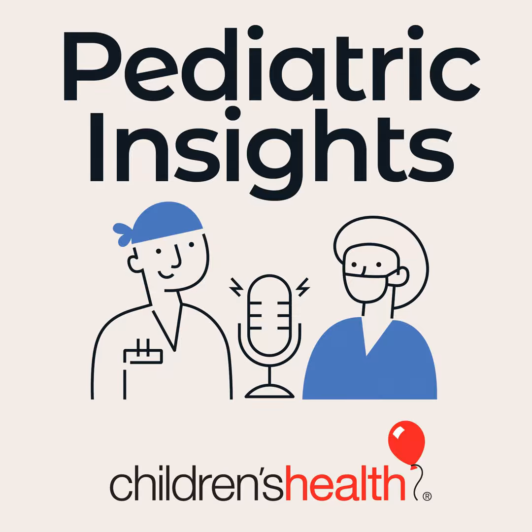So the beauty that I see, even in a very small child, and I use the robot in kids as small as 5 kilograms, and you can do even smaller if you need to, I can still see a wide area around the kidney or the bladder or the pelvis so that I have a whole visualization of the context of the operation without making a big incision. And I certainly have had multiple cases where that has a clear role and a benefit in terms of the outcome of the surgery, allowing me to appreciate differences or variations in the anatomy or the pathology that we're dealing with. Always beneficial, for sure.